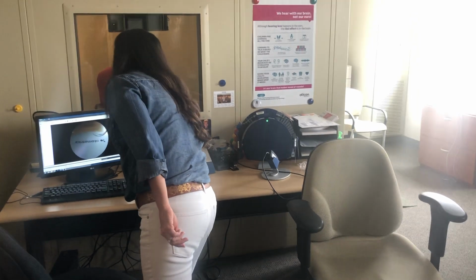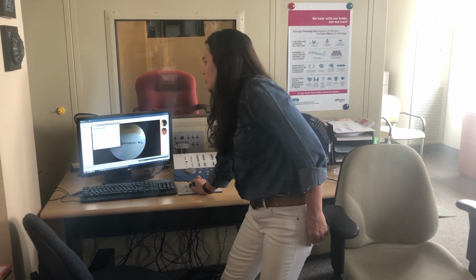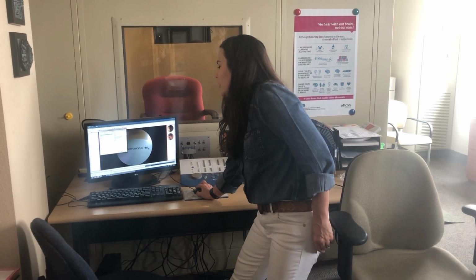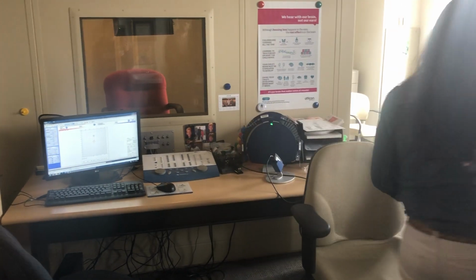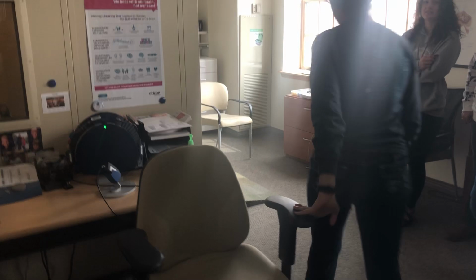So start with otoscopy, then you'll go back to audiometry, adult audio. That's how you switch back to get to the screen to do your pure tone testing. Now to go into the test booth. Melissa, if you'll come in here.